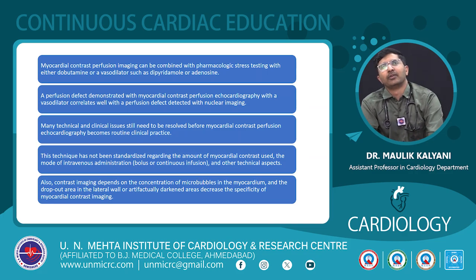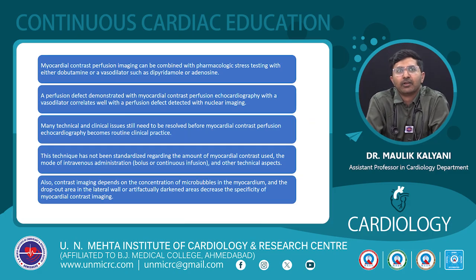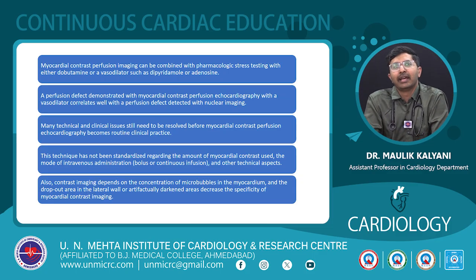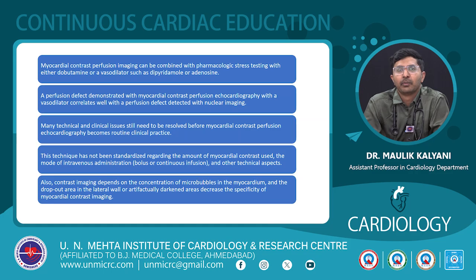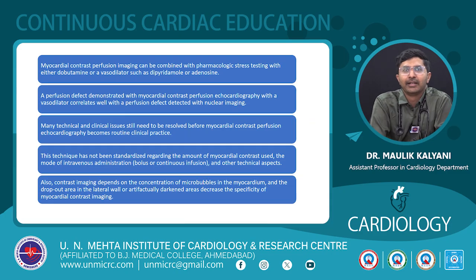Myocardial contrast perfusion imaging can be combined with pharmacological stress, either dobutamine or a vasodilator such as dipyridamole or adenosine. If a perfusion defect is demonstrated before stress, it suggests that area is non-viable because there is no perfusion. But if there is normal perfusion at rest, and then with stress the perfusion decreases, we can say that part has stress-induced ischemia. These results are comparable with nuclear imaging like technetium or thallium.